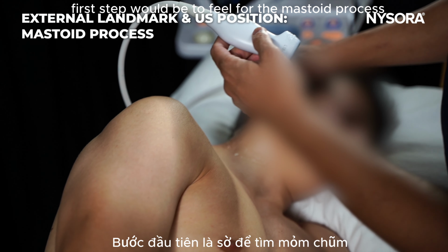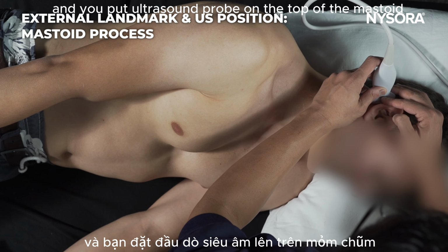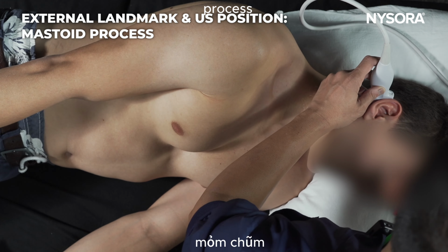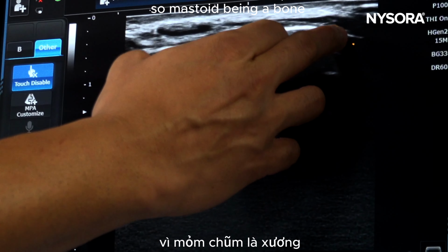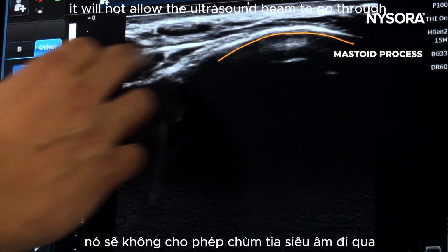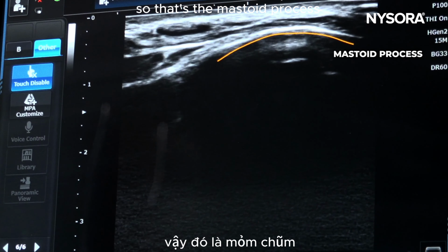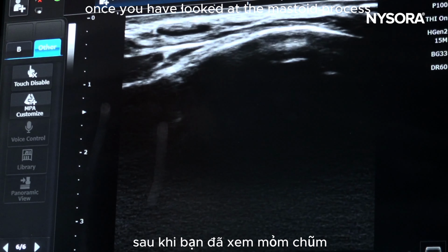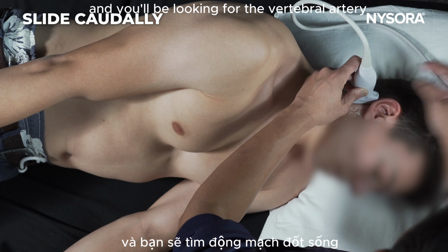Now, the first step would be to feel for the mastoid process, and you put the ultrasound probe on top of the mastoid process, and I'm going to freeze the image and I'll show you. The mastoid being a bone, it will not allow the ultrasound beam to go through, so that's the mastoid process. Once you have looked at the mastoid process, the next thing you will do is to come down and you'll be looking for the vertebral artery.